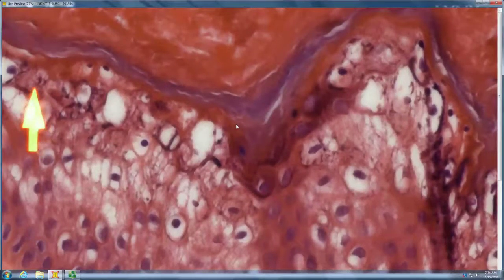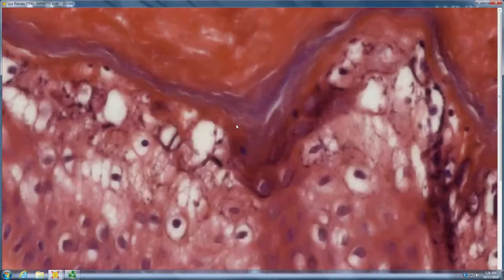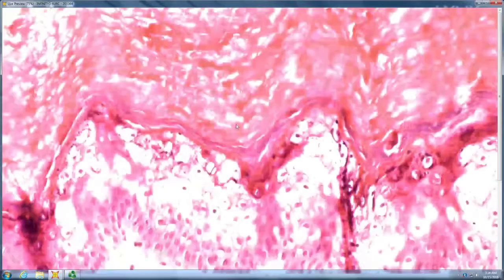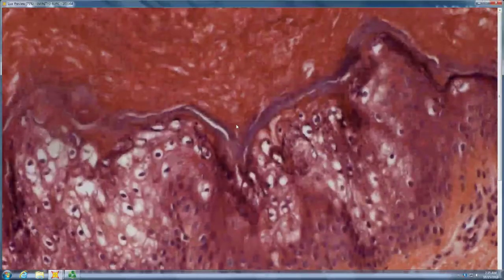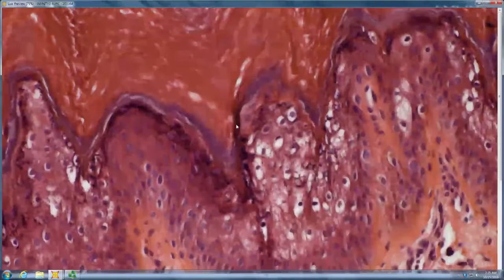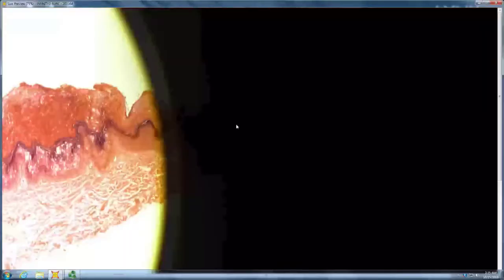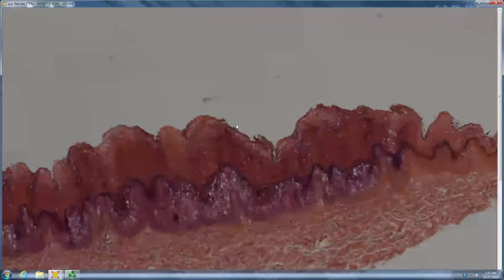It's irregular. Yeah, so they're very irregular, it's all full of holes, and then, not so much in this example, but often there are both red and blue granules, whereas normally the granules should be just blue. So this is? I don't know. Okay. Anyone want to help? Epidermolytic hyperkeratosis. Yeah, EHK, epidermolytic hyperkeratosis.